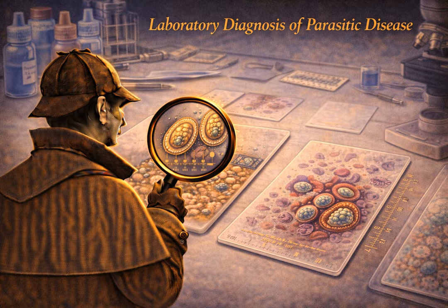The answer is that pinworm eggs, from Enterobius vermicularis, are actively laid on the external perianal skin folds, not deposited inside the intestinal lumen. Therefore, they do not reliably appear in the regular stool stream. You absolutely must use the cellophane tape test or an anal swab in the early morning to manually collect the eggs directly from the skin surface.